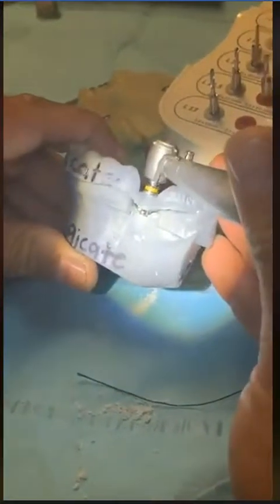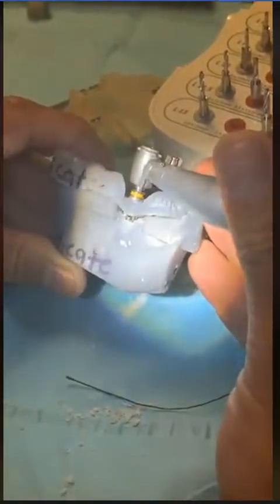Now look at the stopper. Okay, you have nowhere to go but to go exactly where the guide lets you. Okay, take it out.